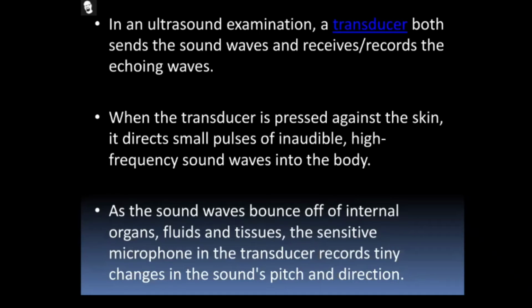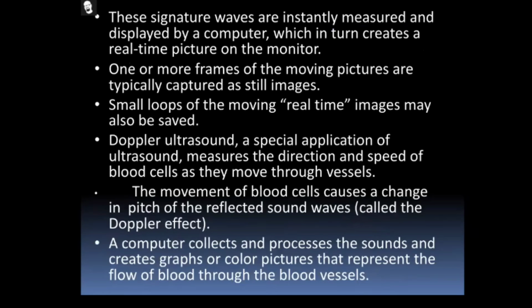These signature waves are instantly measured and displayed by a computer, which in turn creates a real-time picture on the monitor.